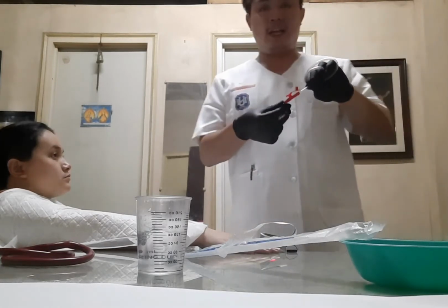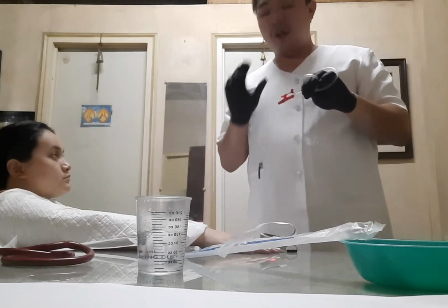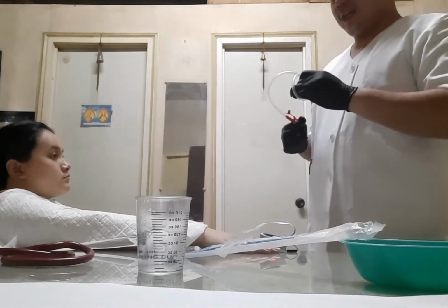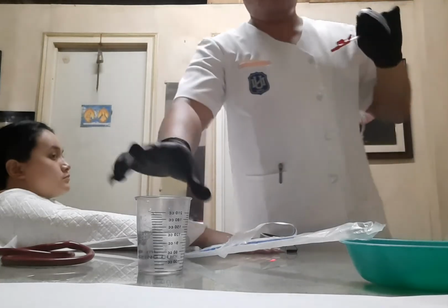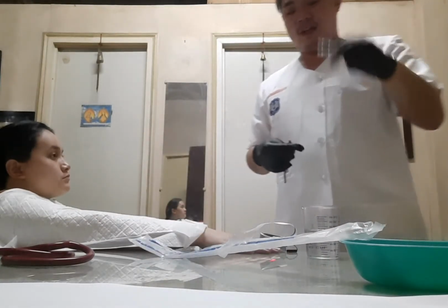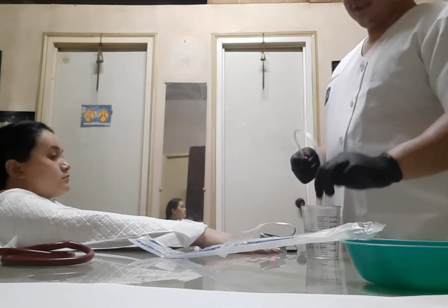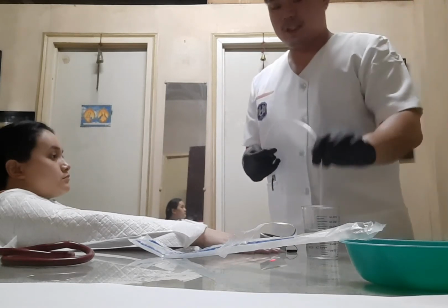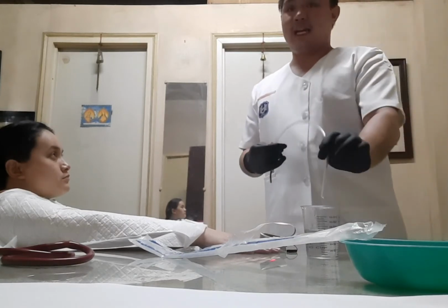Assuming that I already attached the suction hose to my suction catheter, I will be testing my suction catheter first. It's working, assuming that it is suctioning the water, because we don't have an available suction machine.